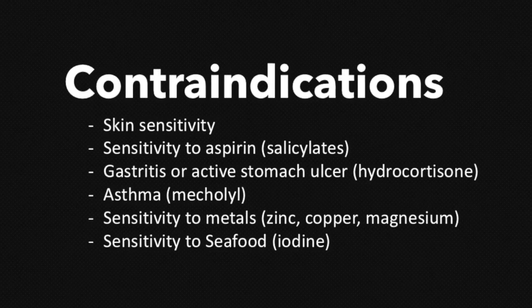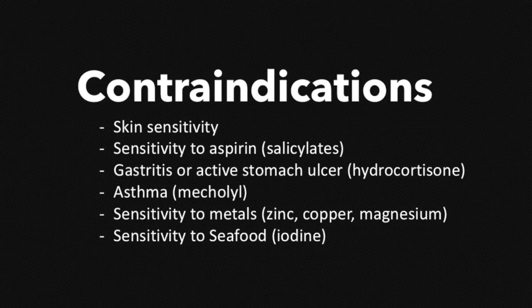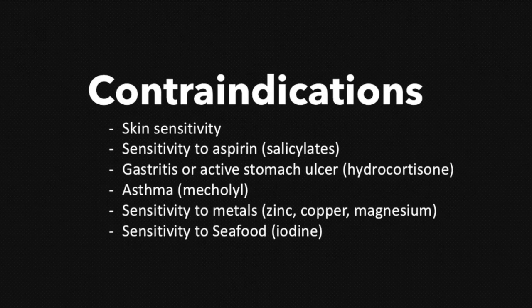Contraindications to iontophoresis include skin sensitivity, sensitivity to aspirin, gastritis or active stomach ulcers, asthma, sensitivity to metals, or sensitivity to seafood.